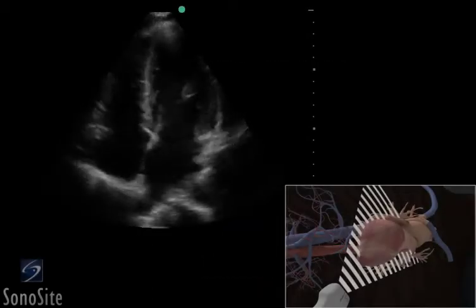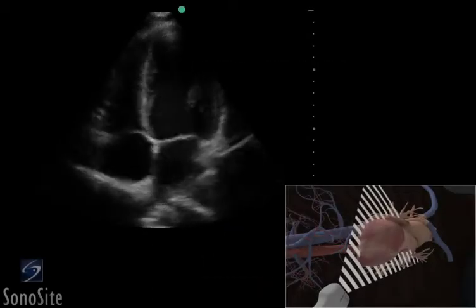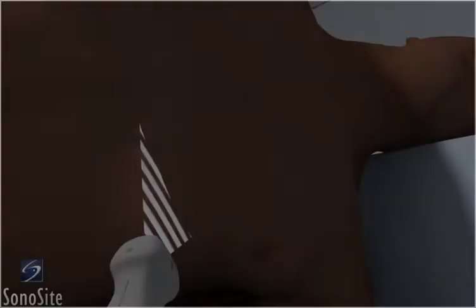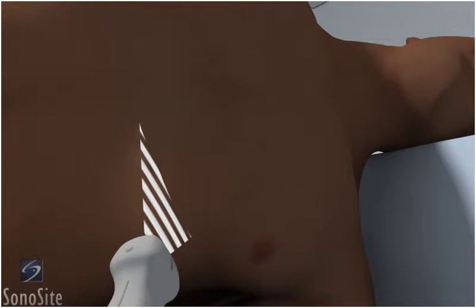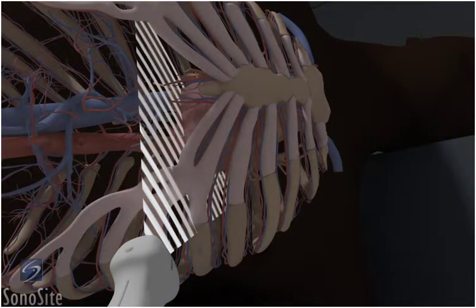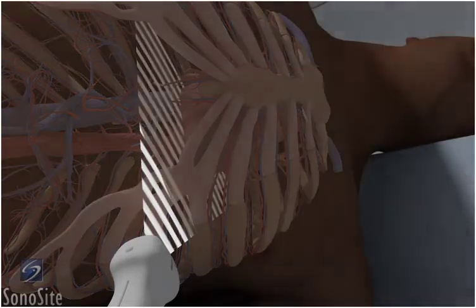A phased array transducer with a cardiac exam type is used to perform the apical four-chamber view of the heart. If possible, place the patient in a left lateral decubitus position to reduce any lung artifact and to bring the heart closer to the anterior chest wall.